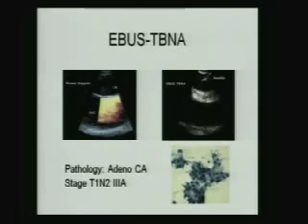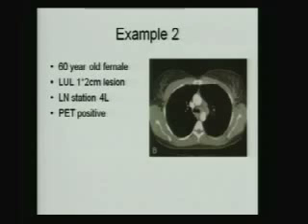Here we see the lymph node visualized at 2R, and this is the superior vena cava, which we saw on the CT, next to the lymph node and recognized by the Doppler flow. That's a Doppler signal. And then a needle was advanced under real-time ultrasound guidance and samples obtained. We were able to diagnose this patient with adenocarcinoma and stage him with one procedure, stage T1 N2, 3A stage. This is just another example to illustrate other stations.